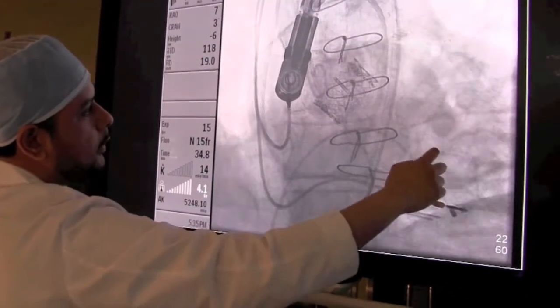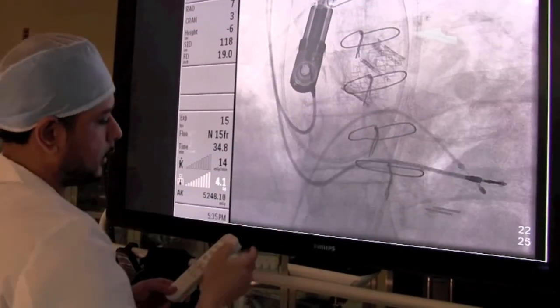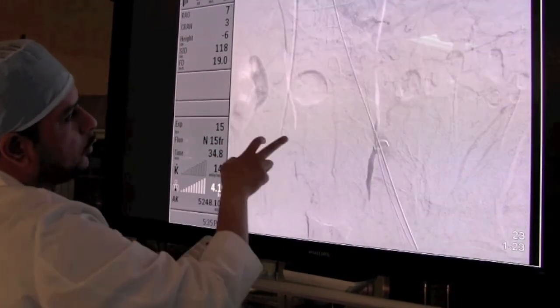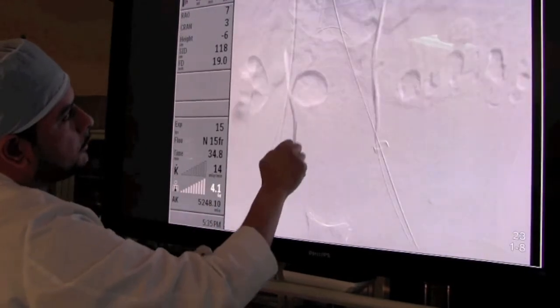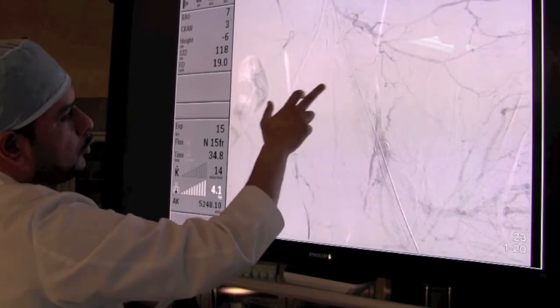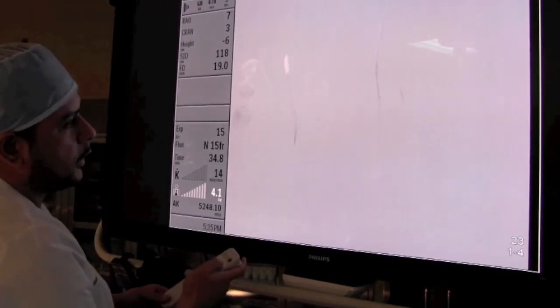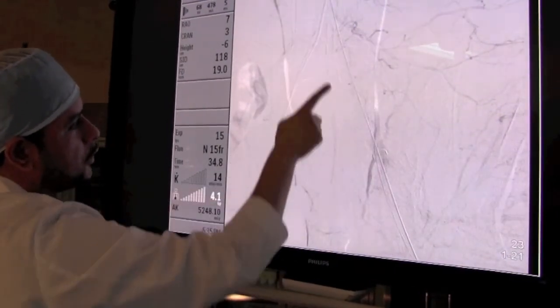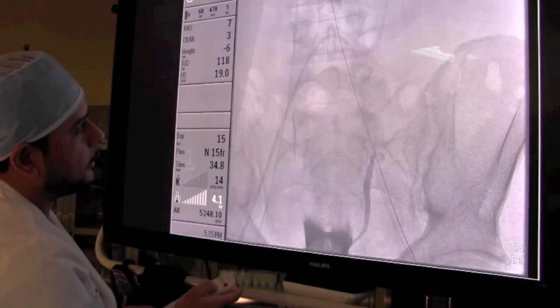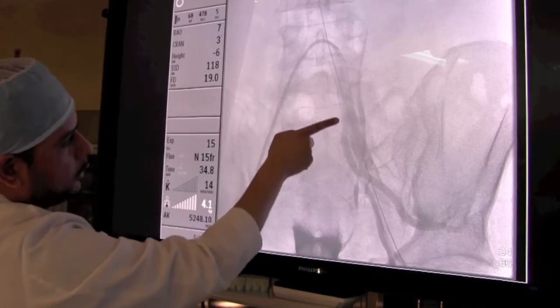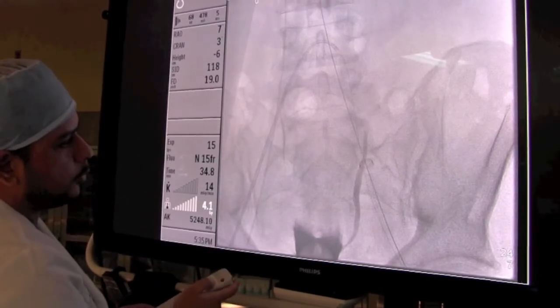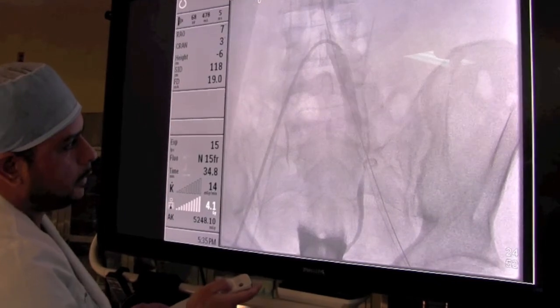This picture shows the two pigtail catheters confirming no pressure gradient. Then at the end of the case we check the aorta and the iliac vessels through which we went to deliver this valve, to make sure we haven't injured them in any way. They look normal — smooth, no irregularities, no evidence of any injury. The big sheath that we used to deliver the valve has been pulled back so we can check those areas, and we take an additional picture of the femoral artery through which it was advanced, and it looks totally normal with no injury, which is very important after placing such large catheters and sheaths.